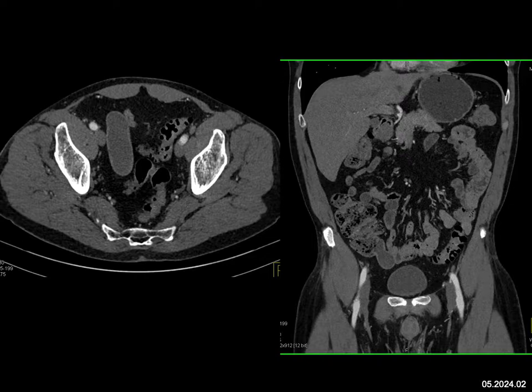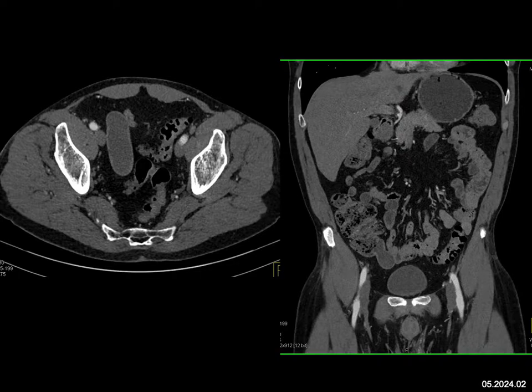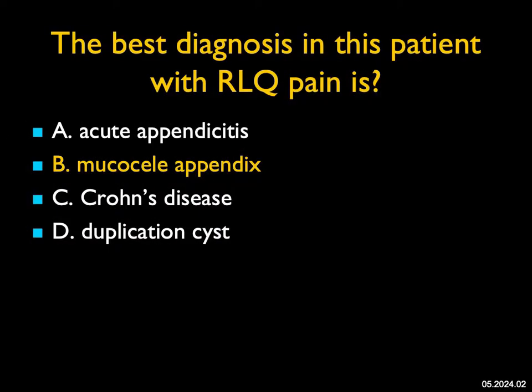This is not Crohn's disease — the bowel looks okay. This is not a duplication cyst, though they can rarely occur off the terminal ileum. Most likely, this is the classic appearance of a mucocele of the appendix. Remember, these can rupture and give you pseudomyxoma peritonei. It's a very important diagnosis to make.